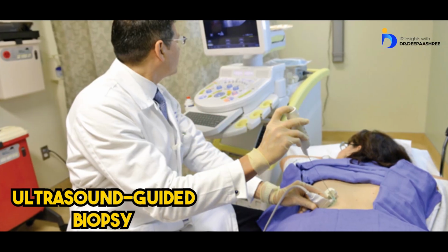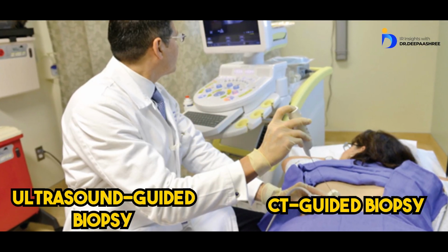Everybody is doing ultrasound guided biopsies, CT guided biopsies. So I said, in order to get over it, from tomorrow onwards, let us start doing ultrasound guided liver biopsies using a coaxial needle. When they're coming out, do the tract embolization, come off. Correct. So they said, oh, we can also do it. I said, that's how we start off.